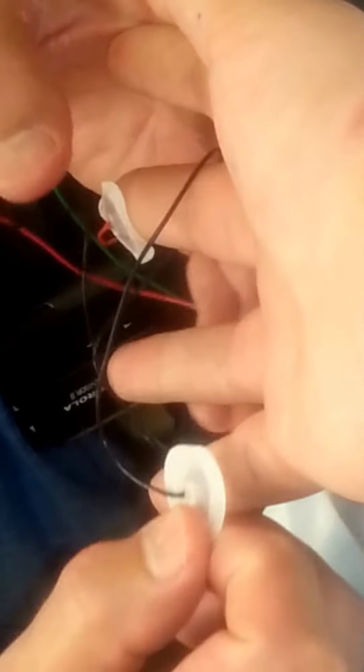Let's do the ulnar nerve to the little finger. So far all of them have been between 2.8 thousandths of a second and 3.2 for the feeling nerves to the fingers. And normal would be anywhere like 3.7 to 3.9 or less, so you're well within normal limits. So now let's see about this 5th finger here. 2.9. Super fast and very big, 52 microvolts in size.